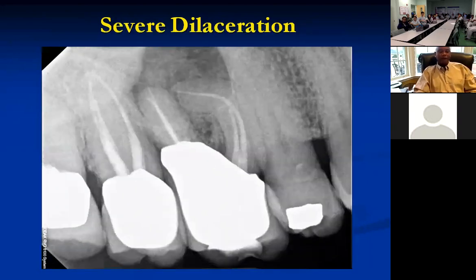And this tooth had 4 canals. Here we've got the MB1 and MB2 in that severely dilacerated mesial buccal root. We got the distal buccal and palatal. We were able to go through the crown, use our microscope, and try to find those canals using ultrasonic instrumentation. Once we find them, we can open them up, use really small, tiny hand files. Maybe we go with a number 6 file, a number 8 file, a number 10 file, and slowly, carefully debride those canals and open them up, and we can treat those.